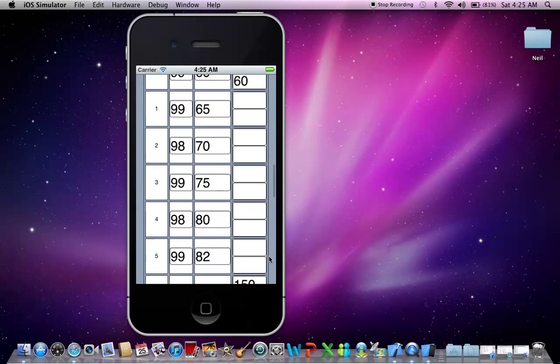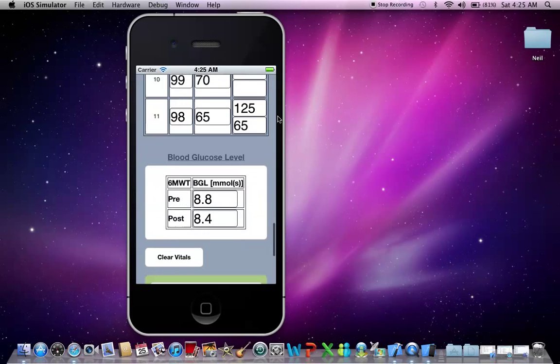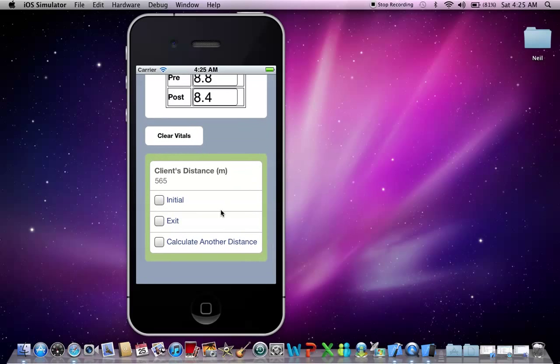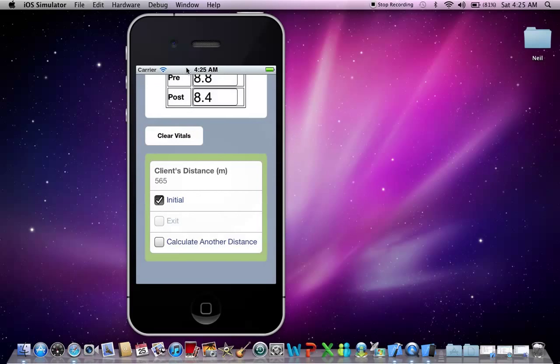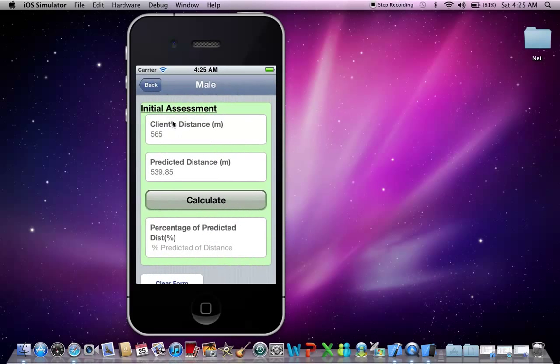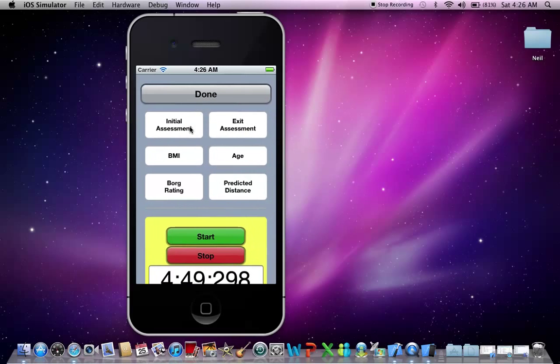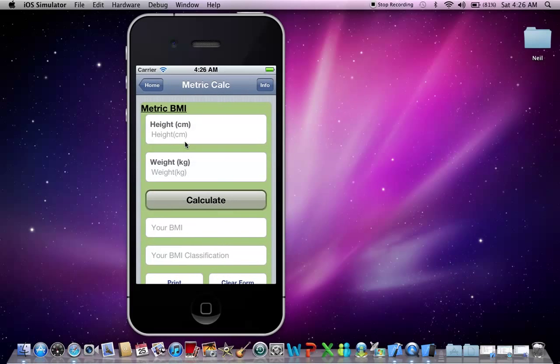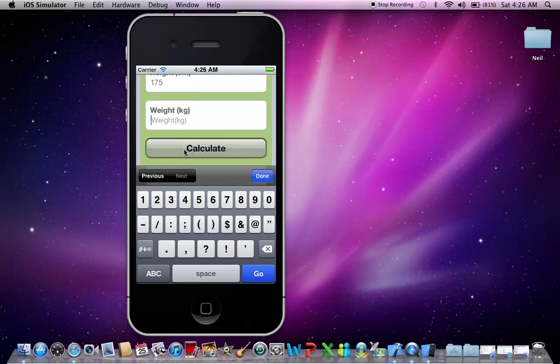Let's scroll down. And there it is there. And let's add that to the initial assessment. Let's scroll back up to the initial assessment, and let's now calculate the predicted distance. Okay, so that client did really well at 104.82%. Let's go back, and let's also put in the client's BMI. Let's calculate that as well.